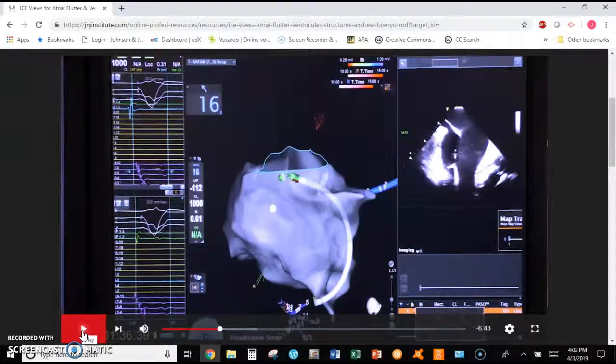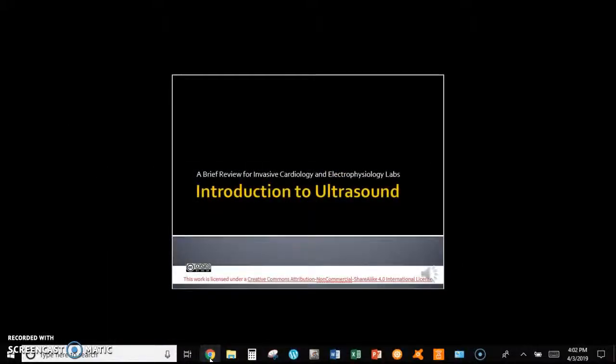And I do recommend that you come back and watch this in its entirety. There's a lot of good information presented, including identifying ventricular structures later on using ICE. The more you see and study cardiac ultrasound images, the better you will be at knowing what you're looking at.